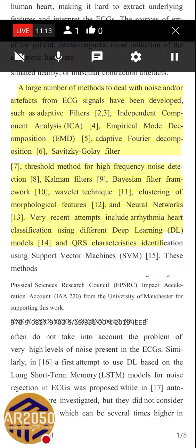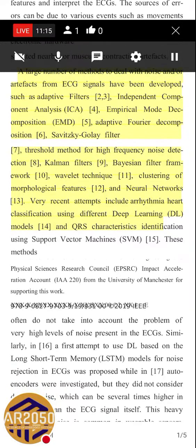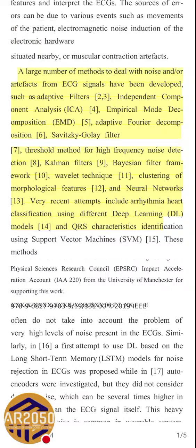Now that we have covered independent component analysis, the next thing is empirical mode decomposition, EMD. This is another technique which is used for denoising. And then we have adaptive Fourier decomposition. This is a frequency domain adaptive method, and this is also a good technique. And the Savitzky-Golay filter. This is also one of the very important filters which is used in various literatures.